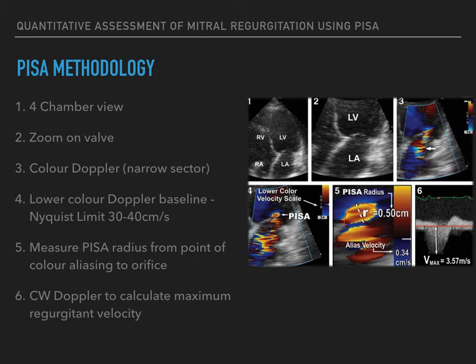Within the PISA are many hemispheric shells. By selecting the shell where aliasing occurs — where there is a distinct colour change, normally from red to blue or blue to red — we know definitively that the velocity at this point is the aliasing velocity, or Nyquist limit, as shown on the colour Doppler scale. Zooming up on the mitral valve in the apical 4-chamber window and shifting the colour Doppler scale downward to approximately 40 cm per second optimises the aliasing velocities, making the PISA hemispheric zone bigger and more measurable.